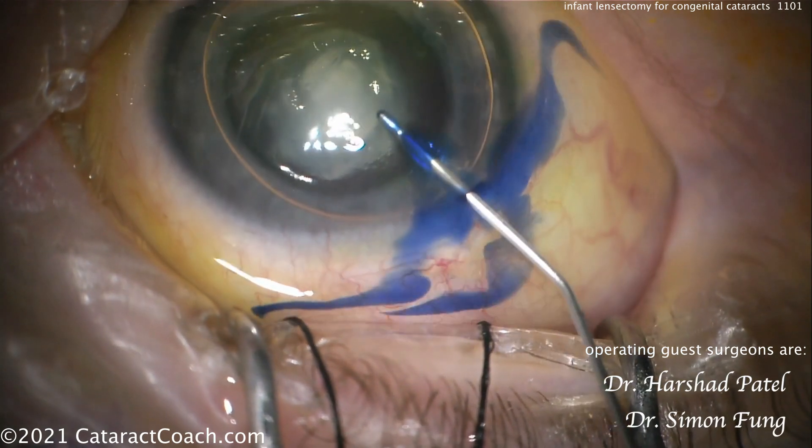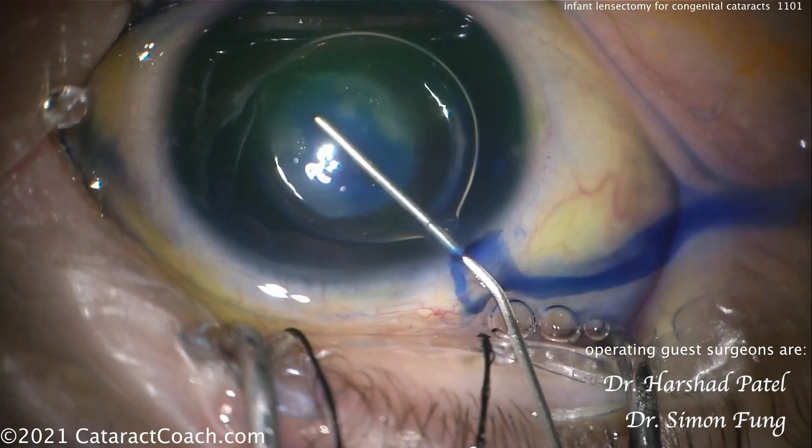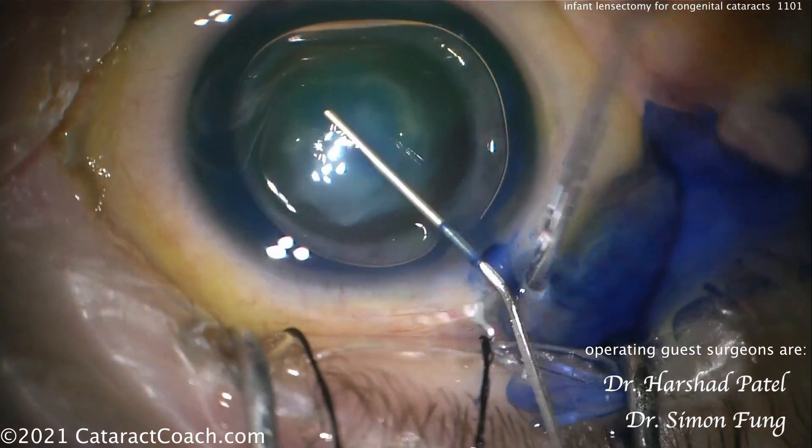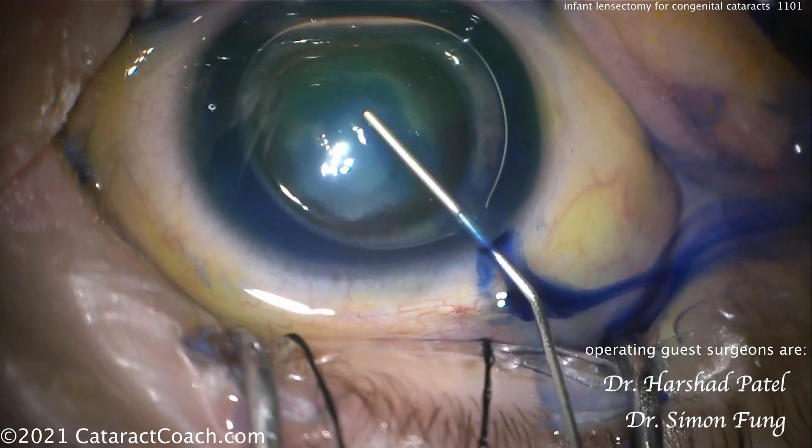Here's making the first incision — a paracentesis. Good incision. I like how the limbal vessels are barely nicked.